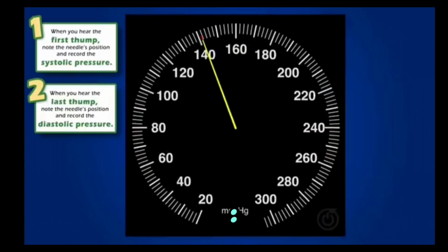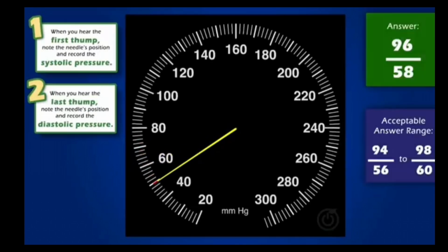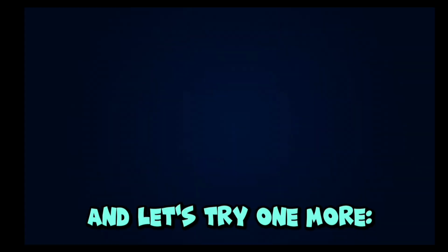Here's the first one, okay? And let's try one more.